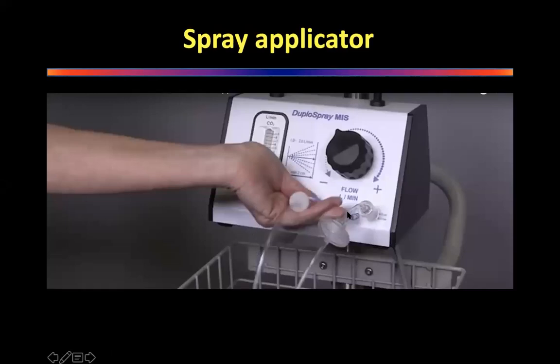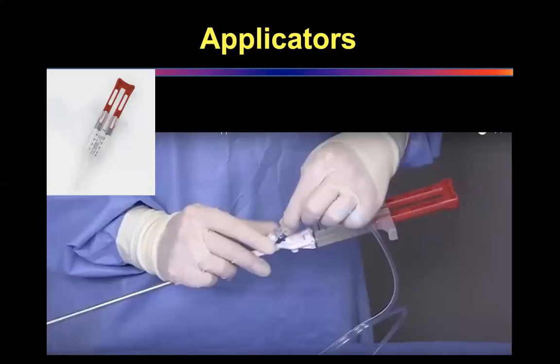Because I do everything by VATS, I use the Duplospray MIS device. This is a very nice device because it allows you to spray evenly with pressure. So the pressure allows you to reach all areas of the lung with a single vial. Whereas if you do dripping, it will all get localized to one area and that might not be adequate.